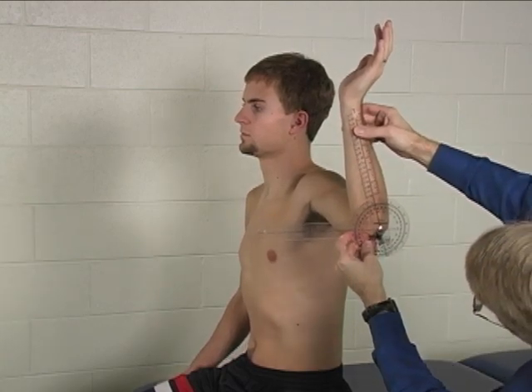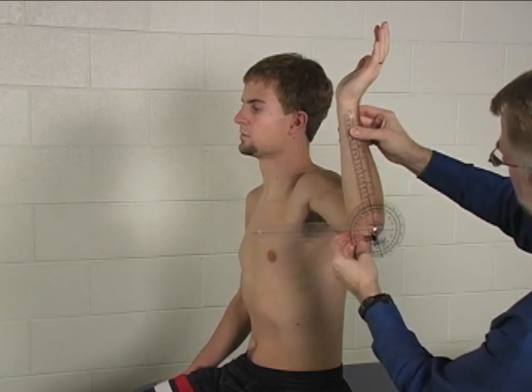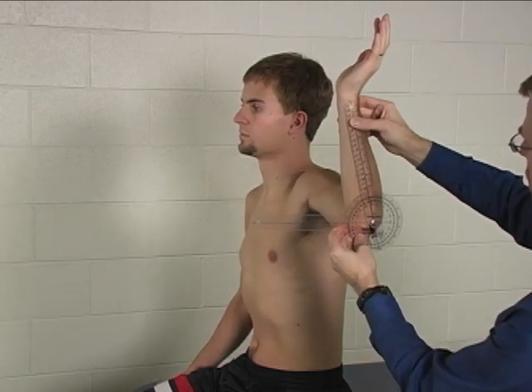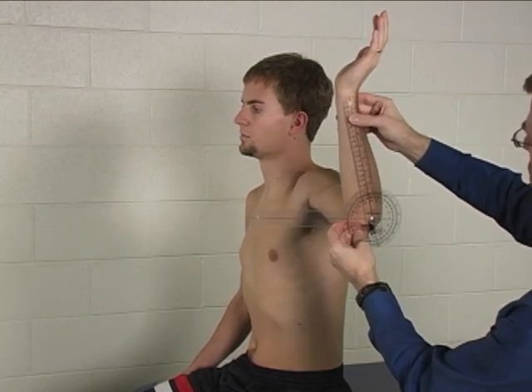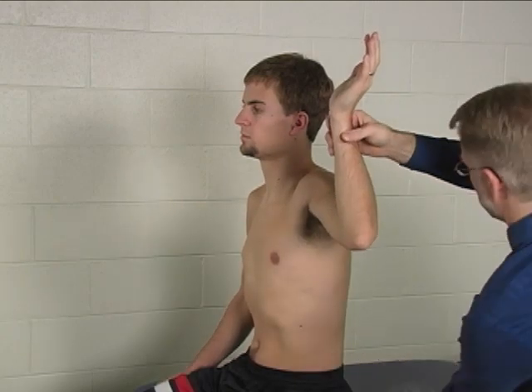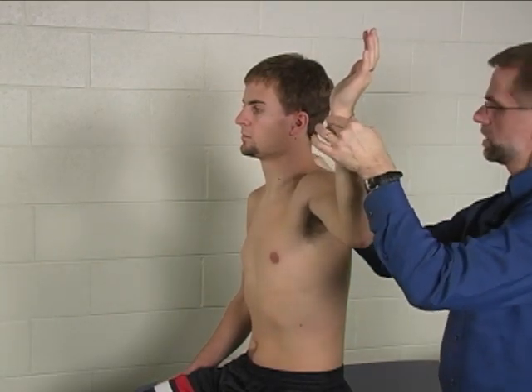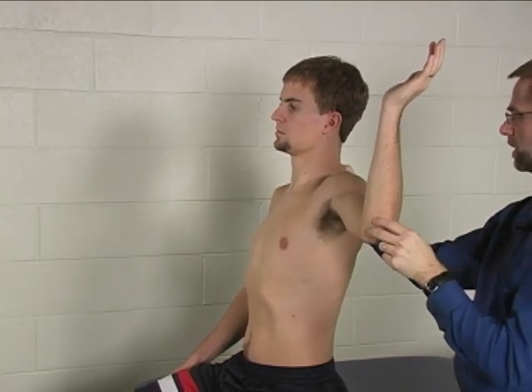Eyeball the stationary arm to make sure it is horizontal, and in this case we have about 0 to 75 degrees of external rotation. Substitutions would include trunk extension, which can make it look like you have more external rotation than you actually have.